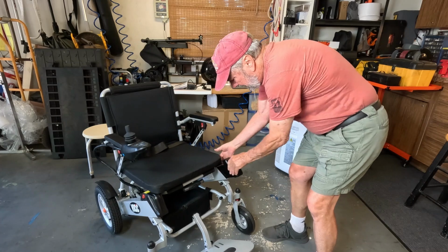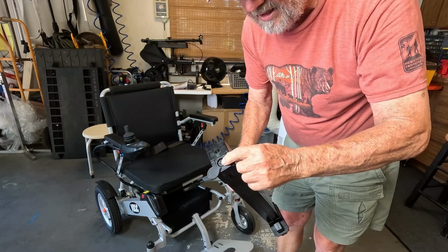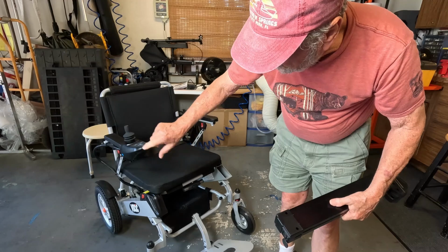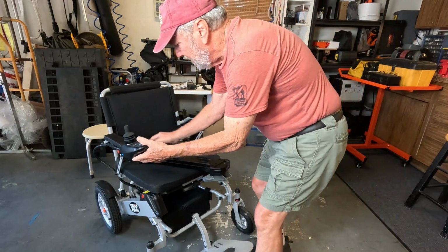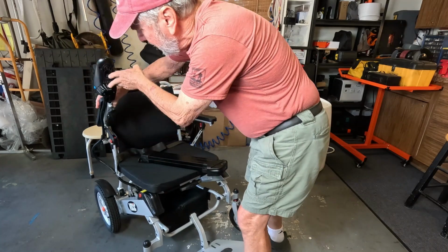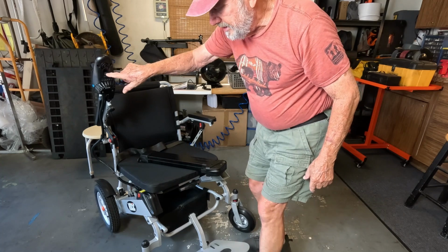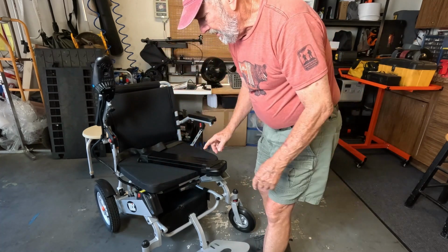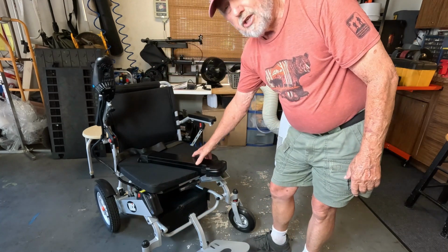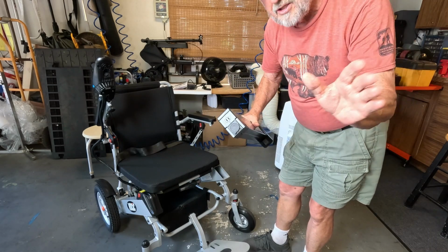This one's the same way, same battery, and it has a charge, so you can charge these independently or through the charging port on this side, which is right there. When you have your charger plugged into here, it's charging this battery. So if you want to charge through there, you'd have to take this one out, and then you can charge this one, or you can just move it to there and charge it. This is up to you.